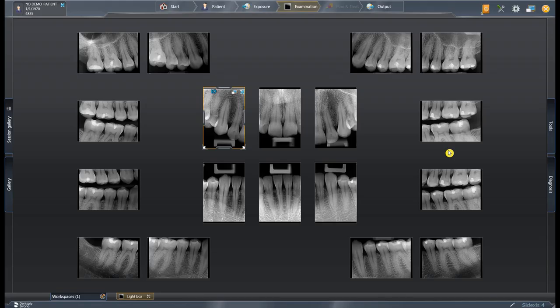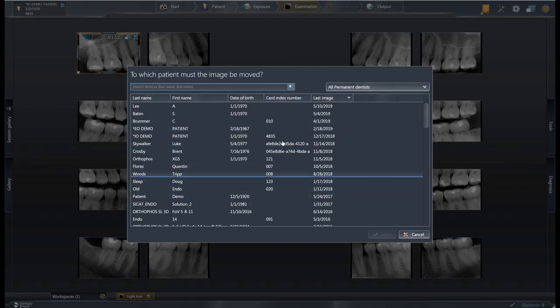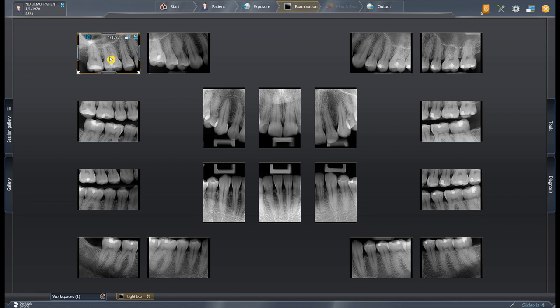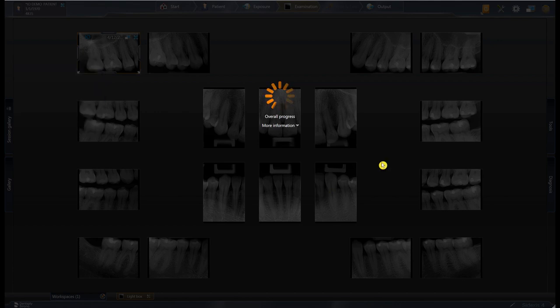When you right-click on an image it allows you to do a few things. Starting from the bottom: if you've taken an image on the wrong patient, you can click Assign Image to Another Patient and it will ask which patient you want to assign it to — this works with 3D volumes, pans, any image type. You can also click Change Image Order, which shows all images you've acquired and lets you drag and drop to reorder them. This is a great feature for when you accidentally take an image out of sequence.